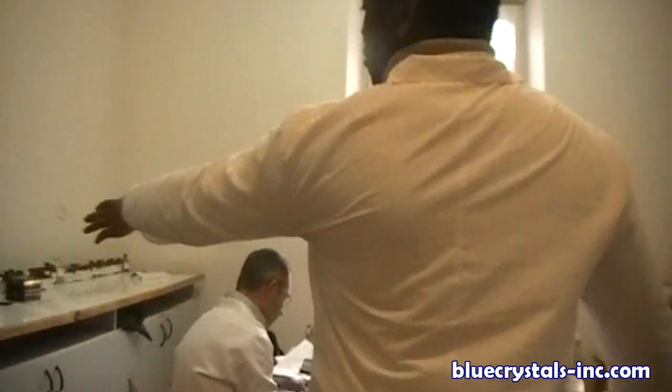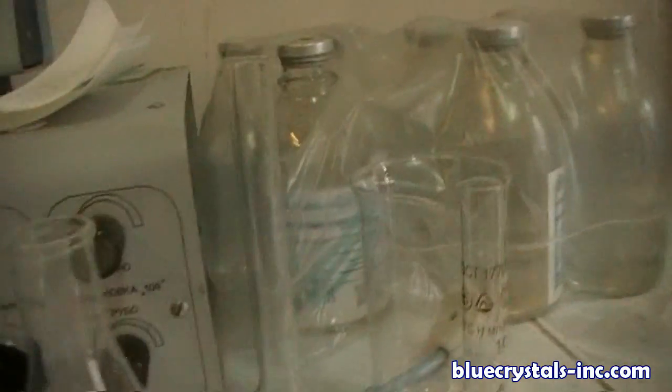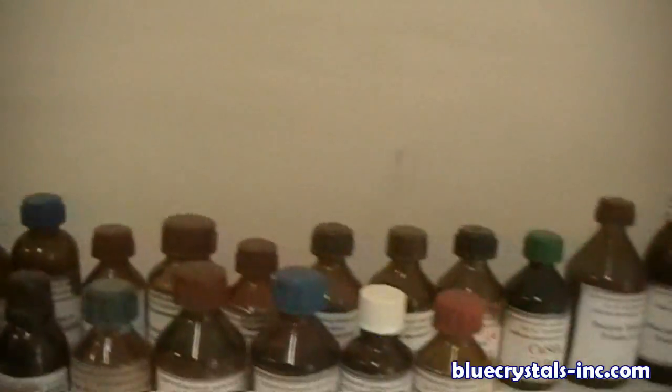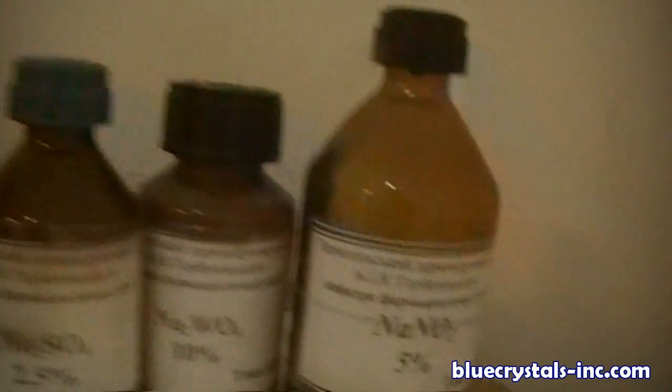And here you have all the reagents. You see all these things are reagents, starting from silver nitrate to down there where you have sodium nitrite.